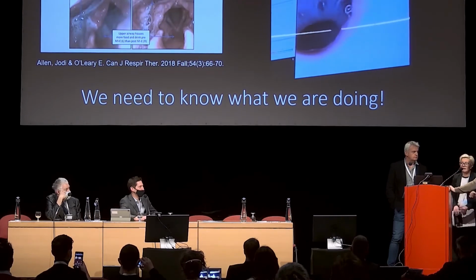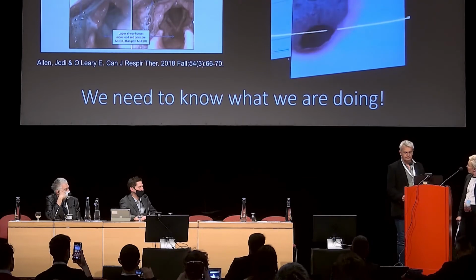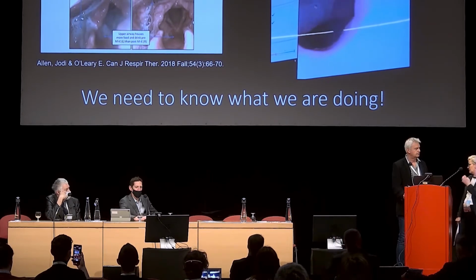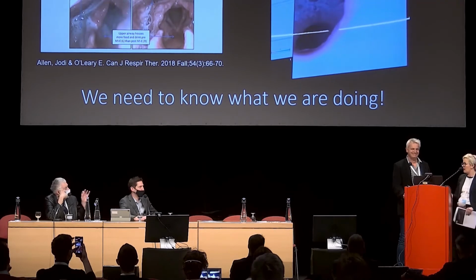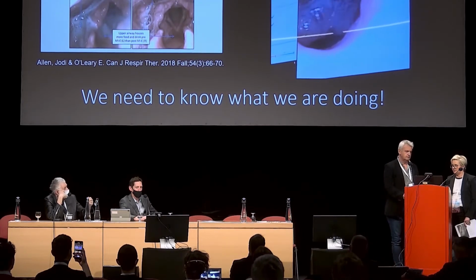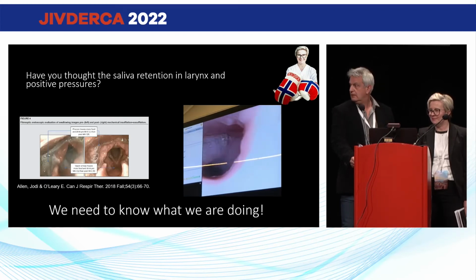Are we okay for you? Yeah, it's okay. Thank you, John. I don't think it's that black and white with upper and lower, as you say, because with the lower motor neuron disease patients, we see that the insufflation is a big problem. But that's another debate. The bottom line is, what is the flow? What is the in-exsufflator expiratory flow? Yes, that's really the bottom line. I think Michelle would probably agree with that. Yeah, maybe.